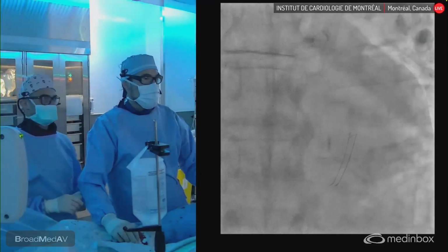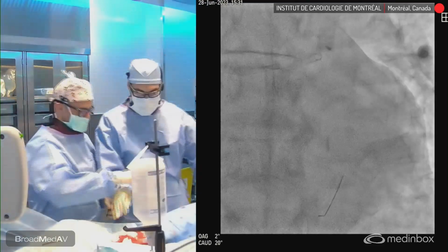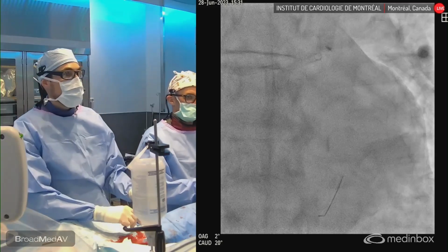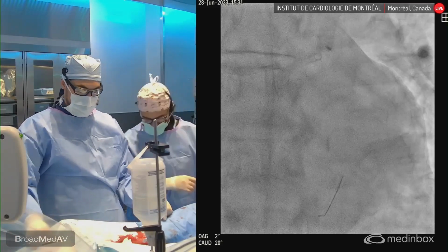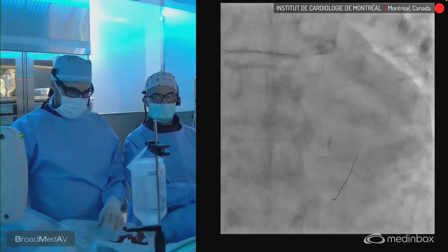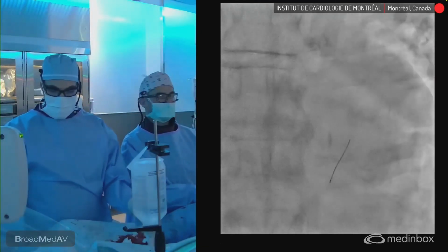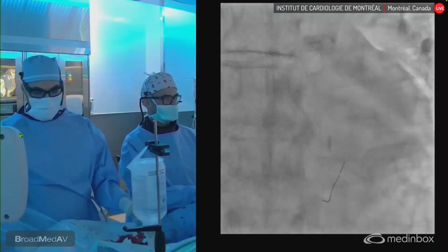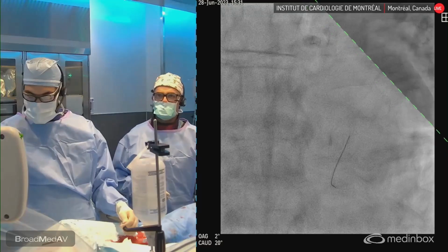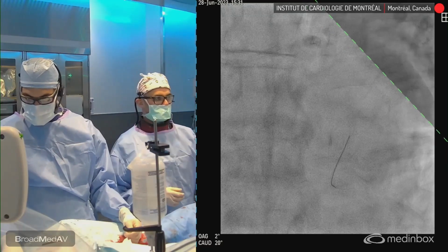Okay, we got it now. So exactly what was suggested was to use a 1.25. So you go with this. What was suggested, Jeff? 1.25 to start. So we say there may also be plaque shift. Did you answer that? Yeah, there might be plaque shift.